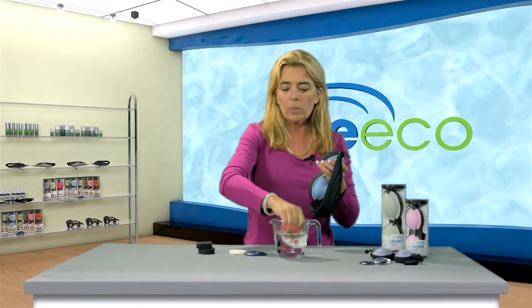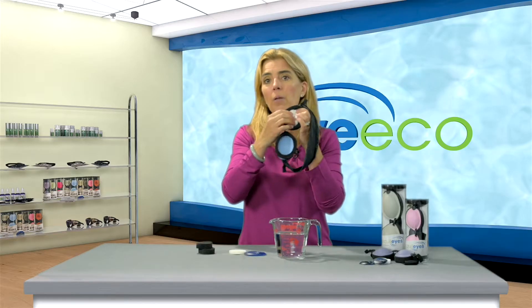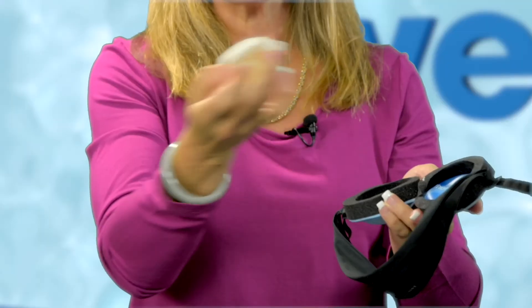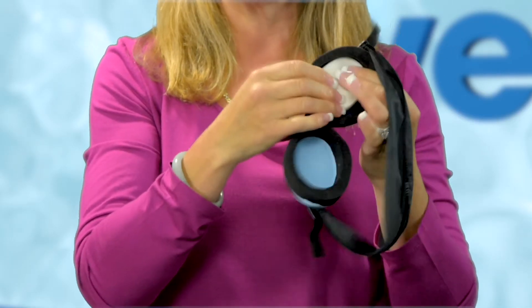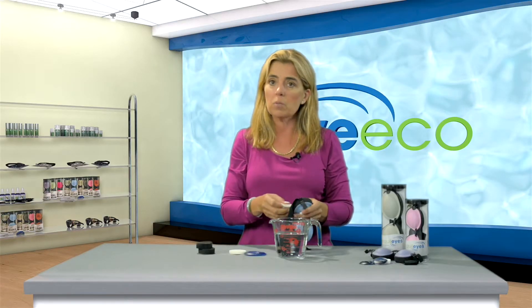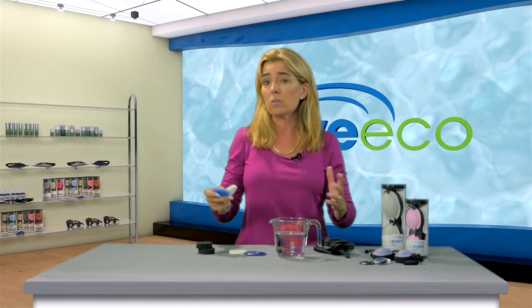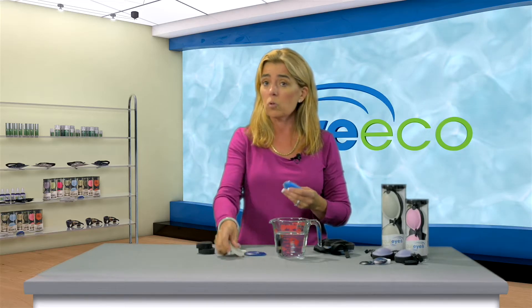Soak this sponge in water — we recommend hot water using bottled water or some kind of water that has no chlorine. Put this on top. Now the combination of the goggle insulating the heat source and the sponge combined is how we get those wonderful long-term results. The beauty of the system is that everything is reusable, it's all natural, and you can reuse these gel packs over and over — well over a hundred times. It's a little bit more maintenance, but it is the Cadillac of what's out there for moist heat, and the results are phenomenal.